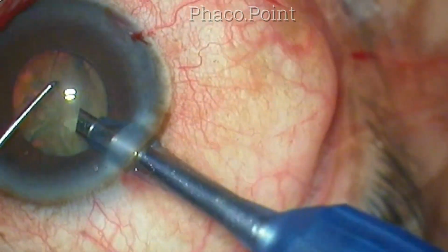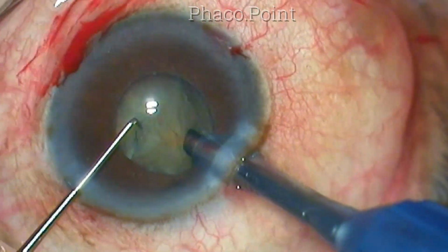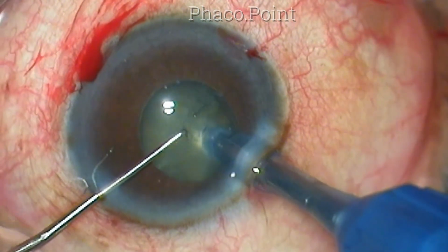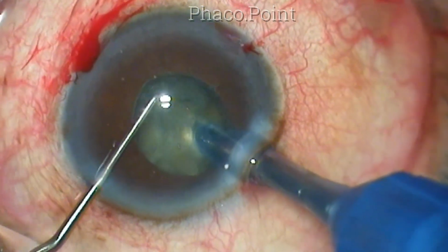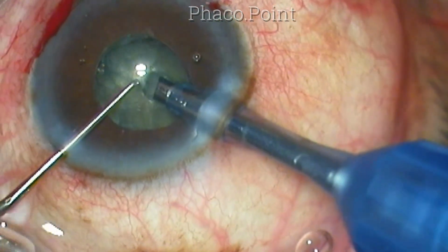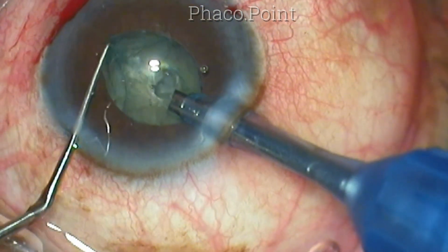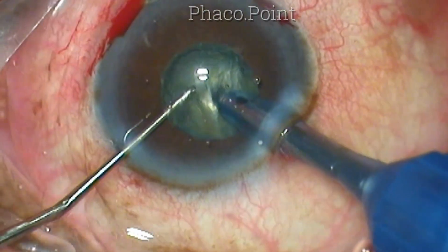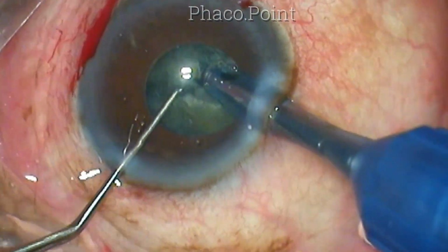Phacoemulsification is being attempted by the direct phaco chop technique and I am using the multi-burst mode using a very low burst duration of just 15 milliseconds and a duty cycle of 65% in my Stellaris machine. The aim and the plan is to create multiple small fragments while remaining within the central zone and not fishing blindly underneath the pupil.